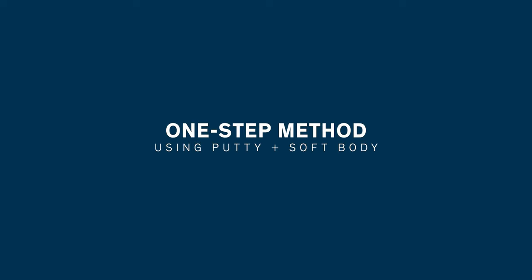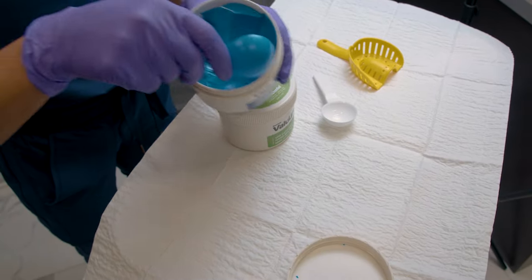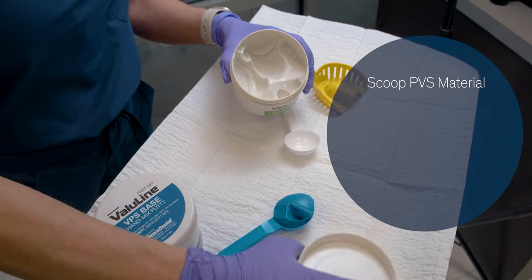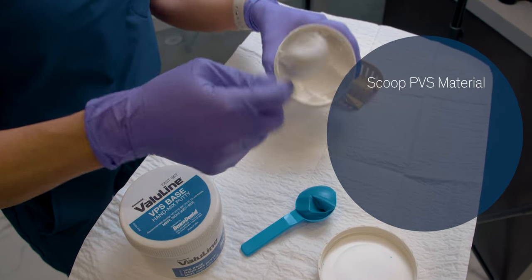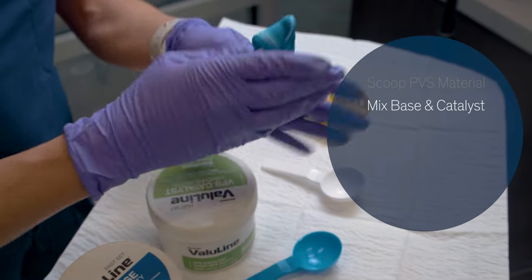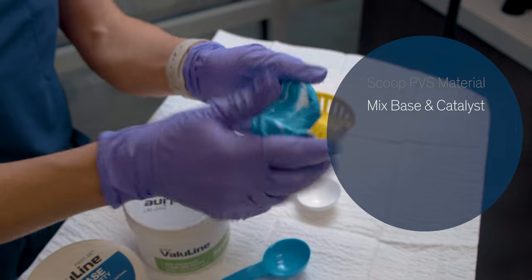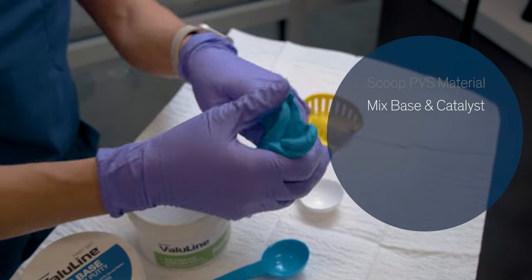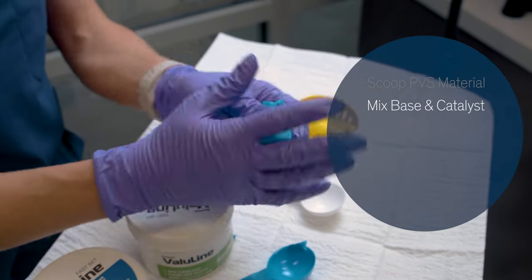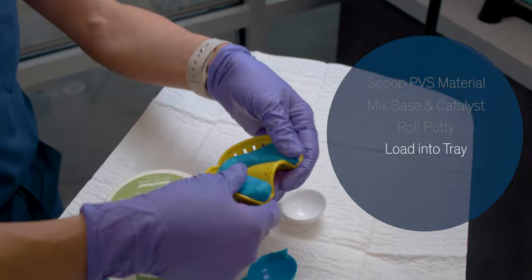Putty is an alternative to PVS heavy body material when taking these impressions. You'll take equal parts of putty material and begin to mix the two pieces together. The goal is to work fast but thorough. As the material starts to mix, you can see a marbling color — we want to mix until the color becomes a uniform color. Once the putty has been mixed, you can roll the putty and then load it into your tray.